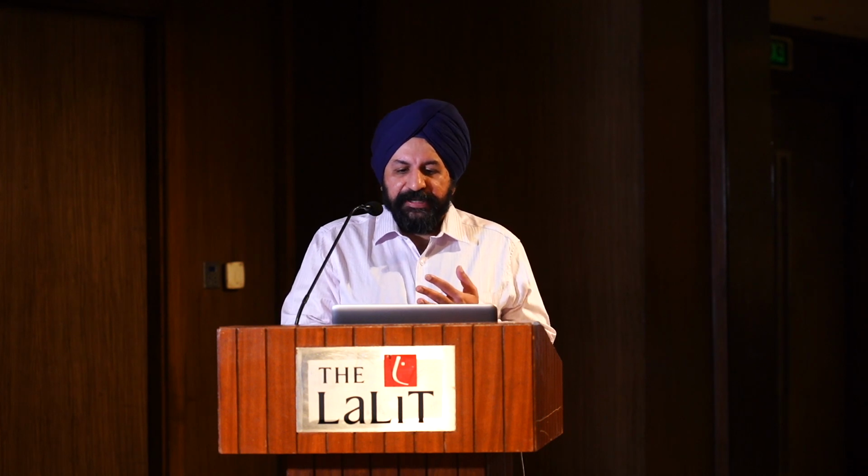So it can assess functional iron availability for erythropoiesis over the past 2 to 3 days. It is recommended by the European best practice guidelines in management of anemia in patients of CRF. And there is no other manual method to measure ret hemoglobin. It can only be measured through an analyzer.